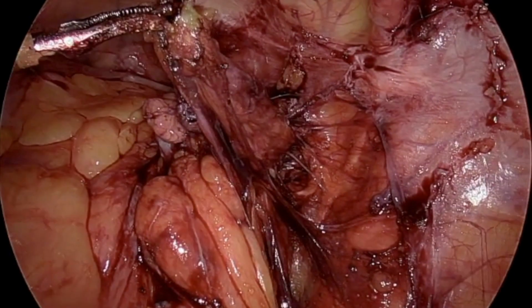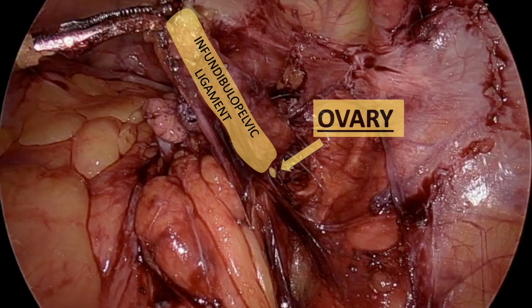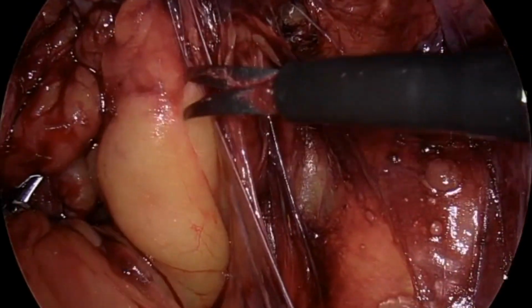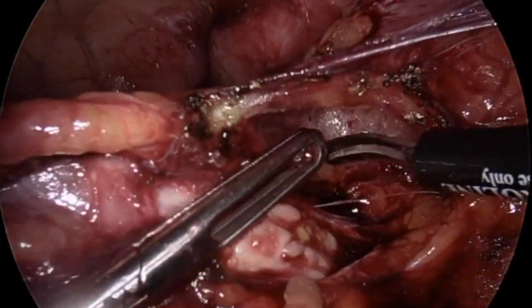In cases with significant adhesions, the ovary may be difficult to identify. It can be found by tracing the infundibulopelvic ligament. We then begin step 4 and excise the ovary off the pelvic sidewall. In this case, we notice dense adhesions anteriorly and posteriorly.